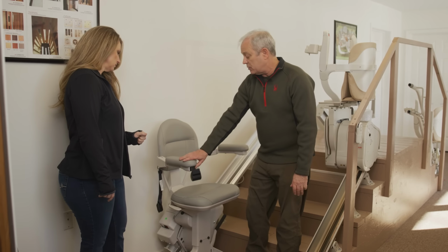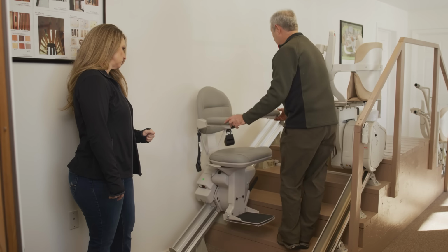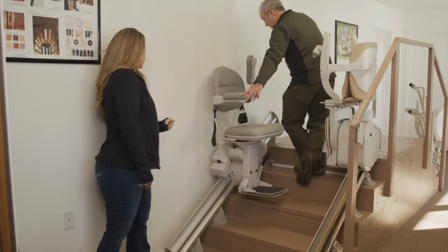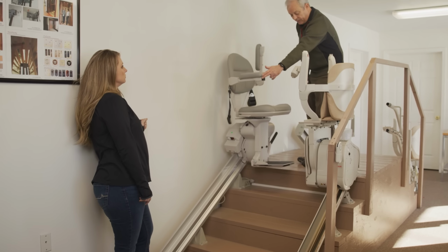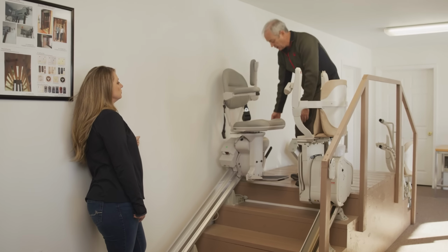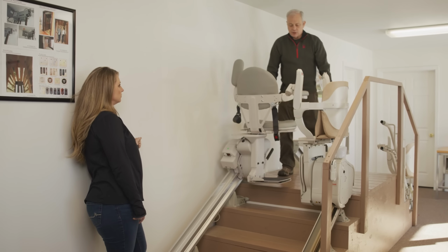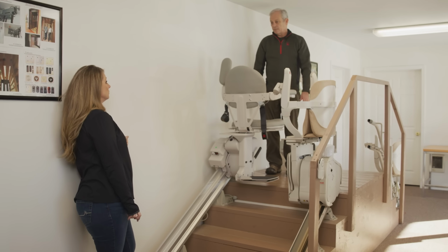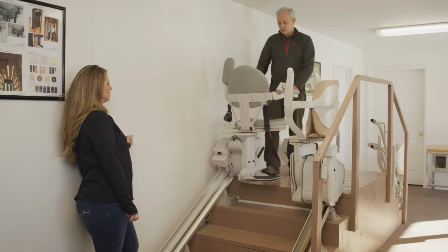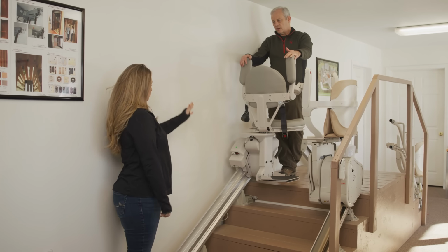When this lift gets to the top level, it also has the ability to swivel so that you can safely transfer into it without feeling like you're going to fall over the stairs. They can swivel and lock in position like this so that you can have the wheelchair a long ways away from the top of the staircase. So these are the things that are important for somebody with ALS as far as transferring.